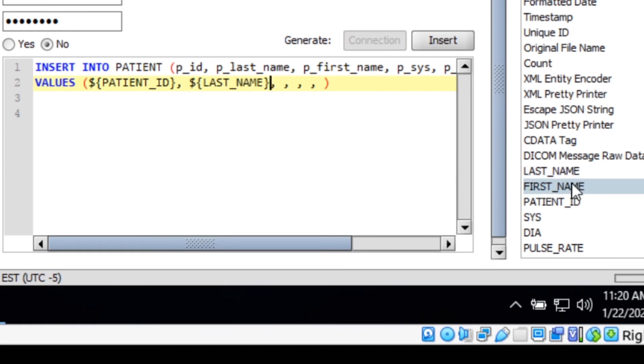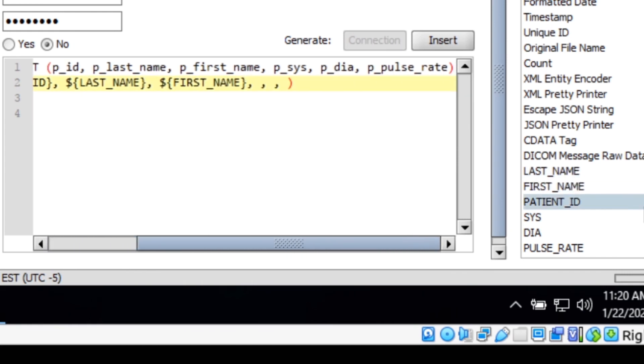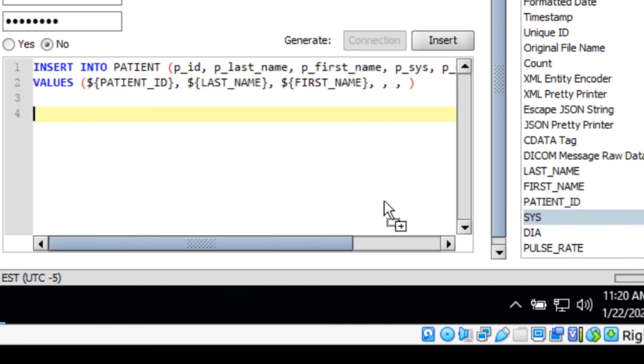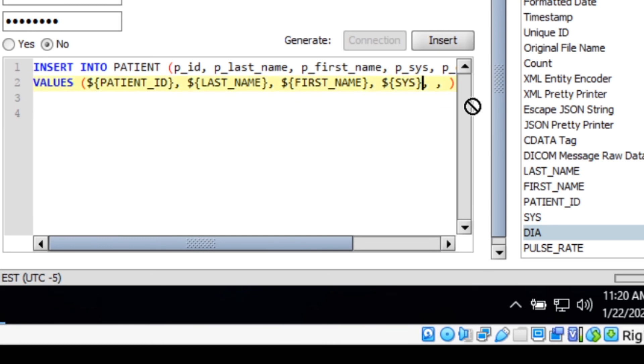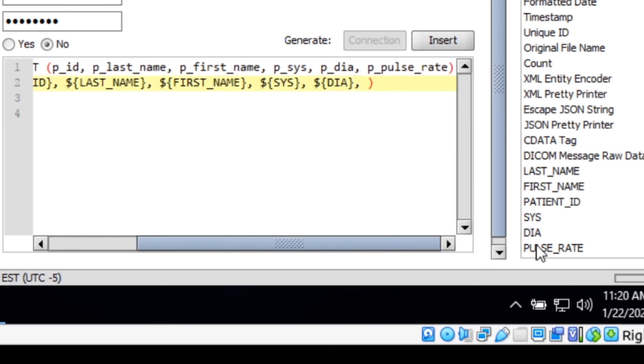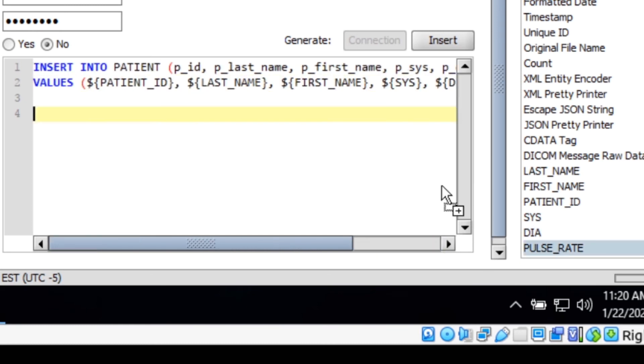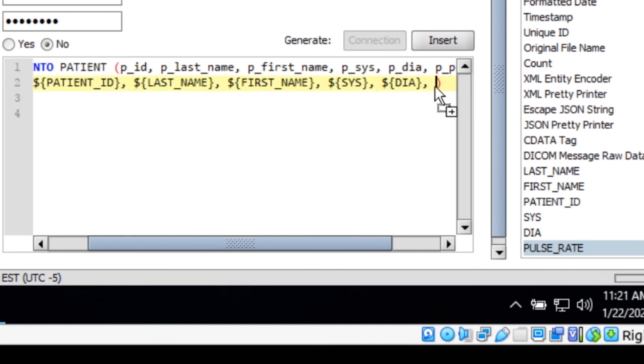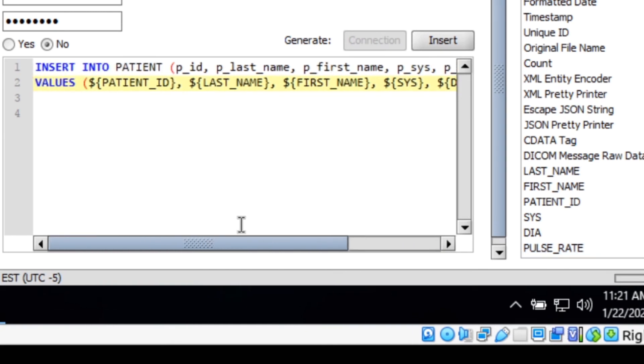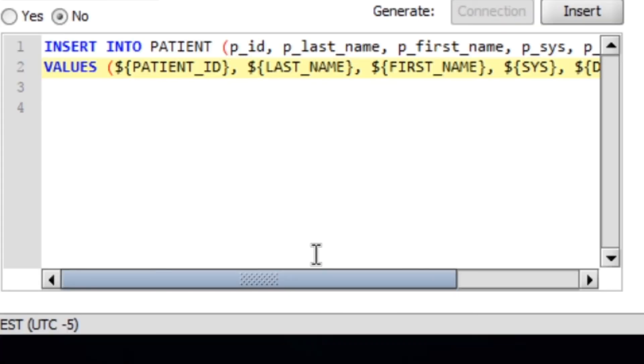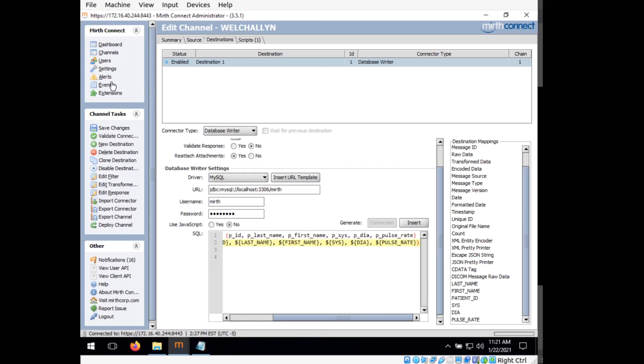And then the first name, same for that. And the vital signs. And finally, the pulse rate. So this is what it should look like. And you can see it just matches what we have over here. And now we can click save changes.